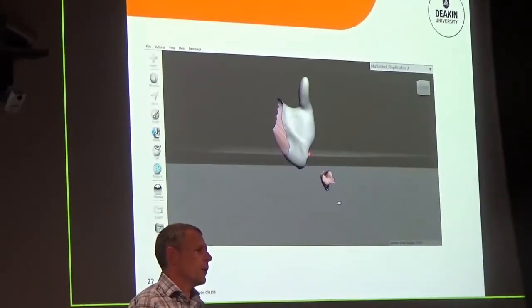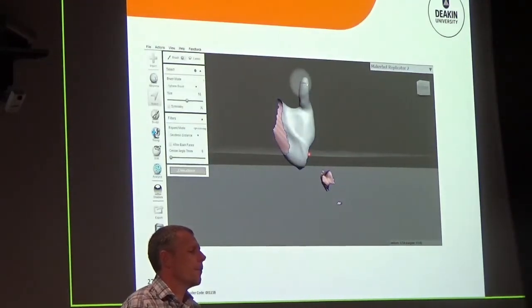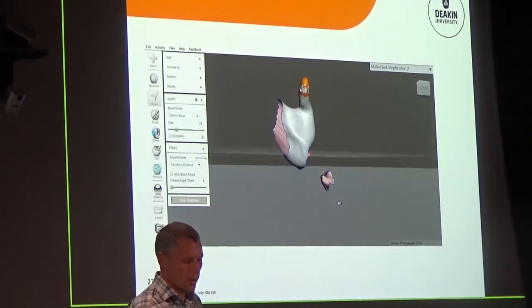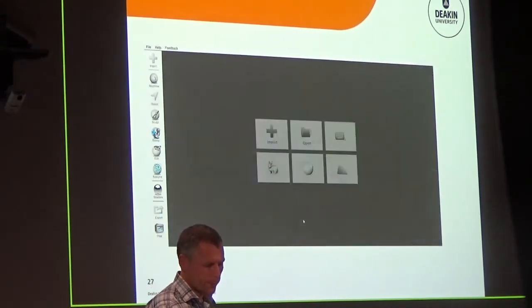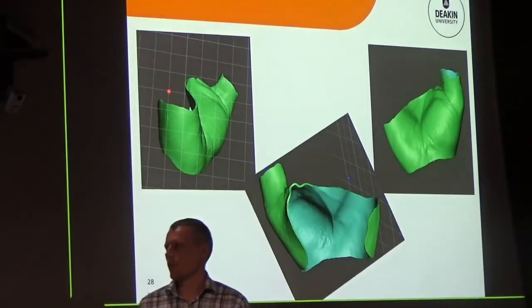So by doing that, we have now got this image and this section of the part of the body that is absolute, the right position or the right measurements of that person's body, and being able to modify that to create what would then lead to these. So then we created into that aspect. We've now got an image that is the exact replica.